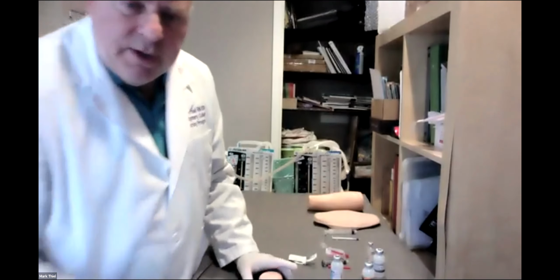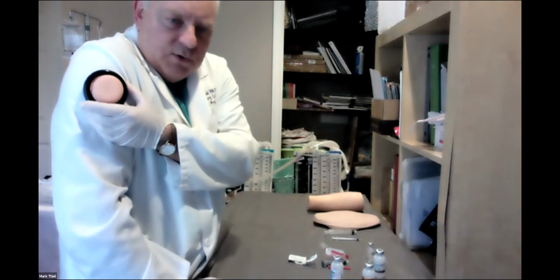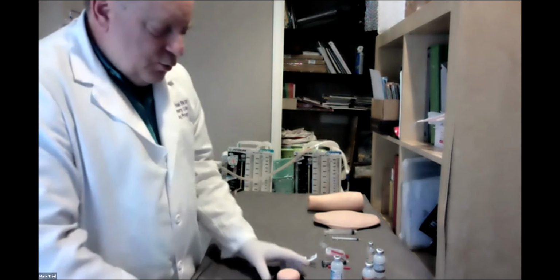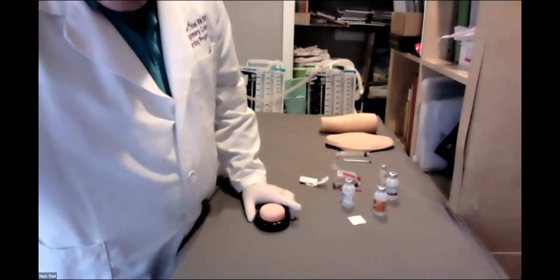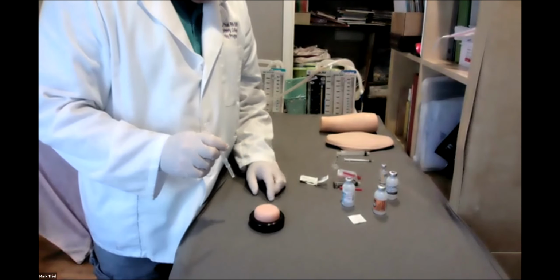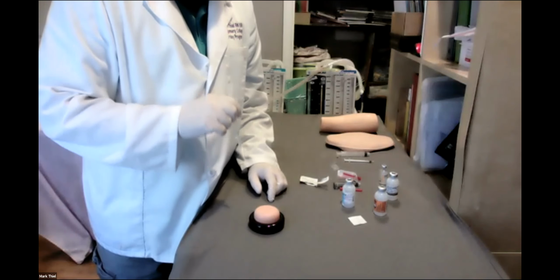Today, as I mentioned earlier in our session, this will be my deltoid muscle. I've identified my site right in the middle of the deltoid. Now, obviously, it's not up on my shoulder, so I have to demonstrate down. Think for one moment, what is the distinction about an intramuscular injection?